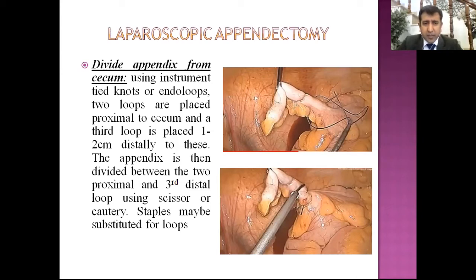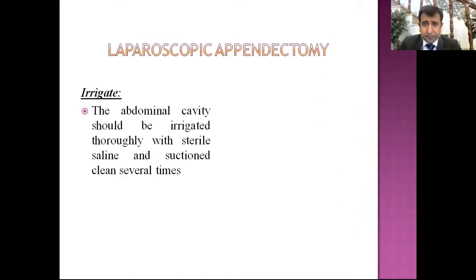Staples may also be substituted for loops. And if resources are available, then you can use a blue color staple for the appendix. And that's not expensive, I think. If we are doing laparoscopy, we should master the knotting skills. That will help in many other surgeries.